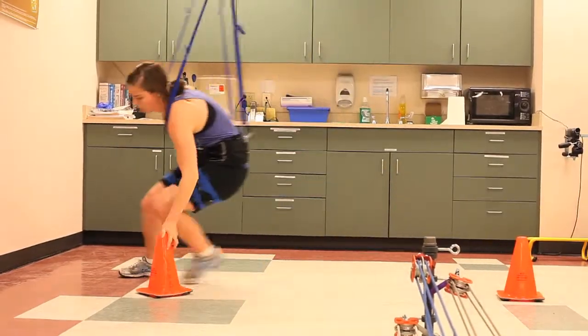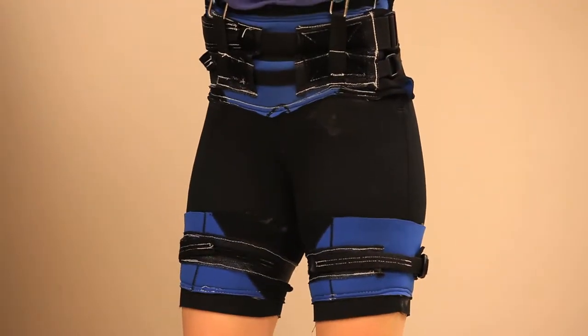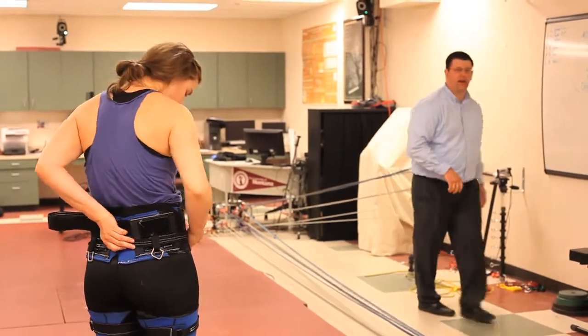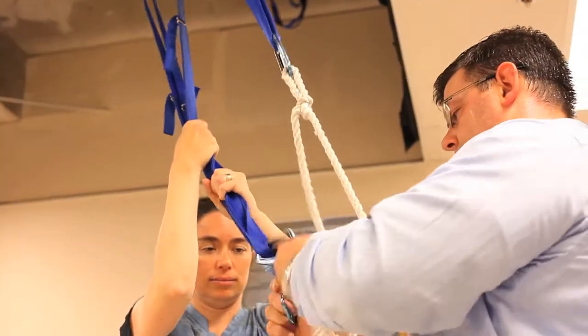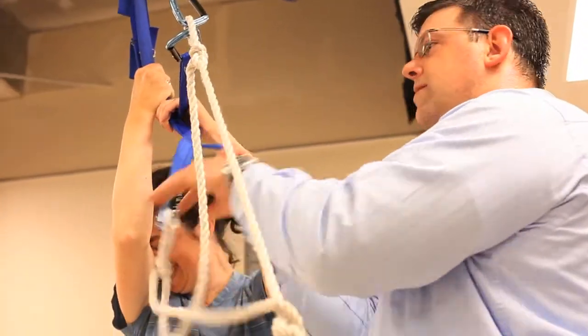I'm excited about getting our students engaged in the science related to that. They're presenting at conferences and submitting abstracts, and we're submitting new grants related to this. I really think the price of that tool and its versatility across different populations — not just ACL reconstruction, but retraining someone with a total knee replacement how to do stairs, or working with people who have extra fear like those afraid of falling — giving them a safe, comfortable environment to retrain is really exciting.